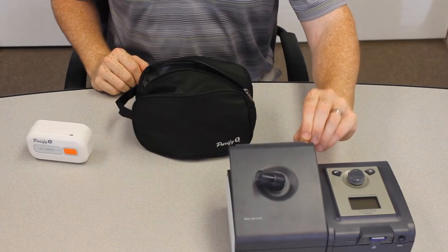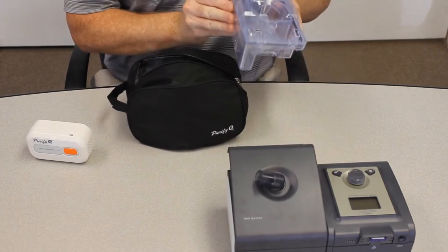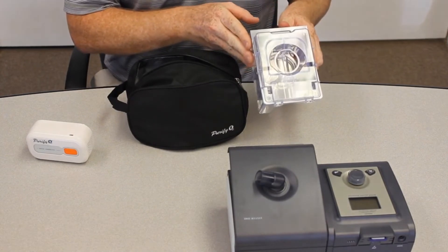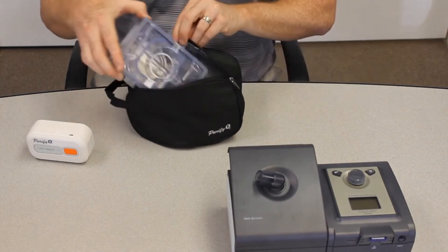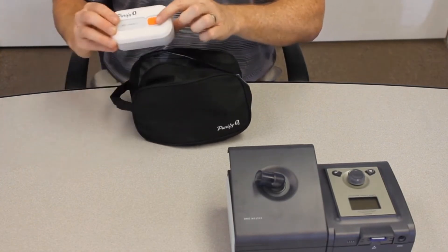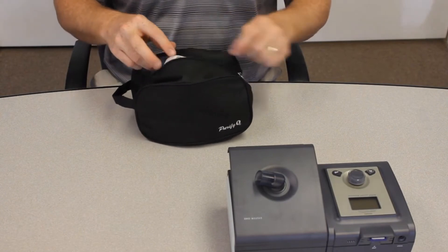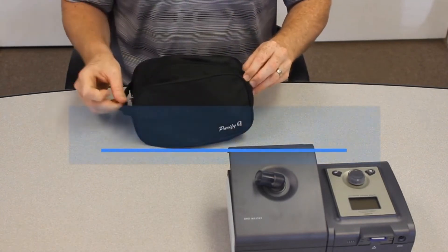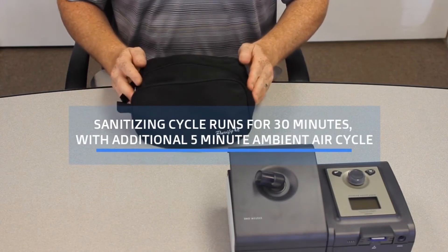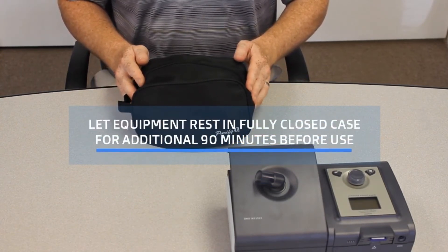We will now sanitize the water chamber. If you have any water in your chamber, go ahead and empty that out. Put the chamber into the sanitizing case. Hold down the on button for three seconds, put the Purify O3 in the sanitizing case, and go ahead and seal that up. The unit will run for 35 minutes and then we'll wait an additional 90 minutes.